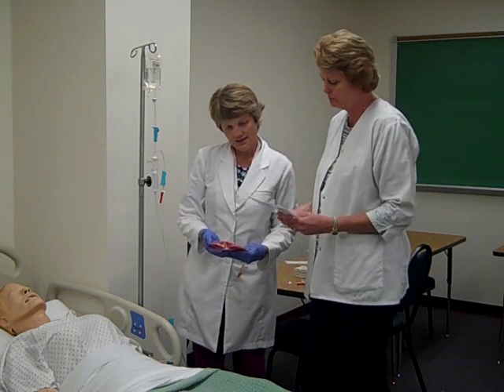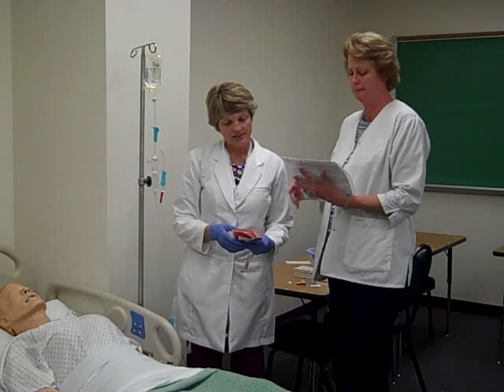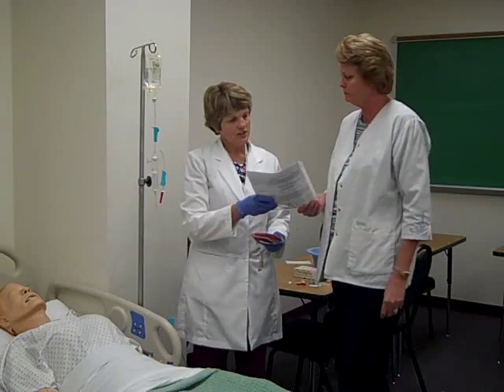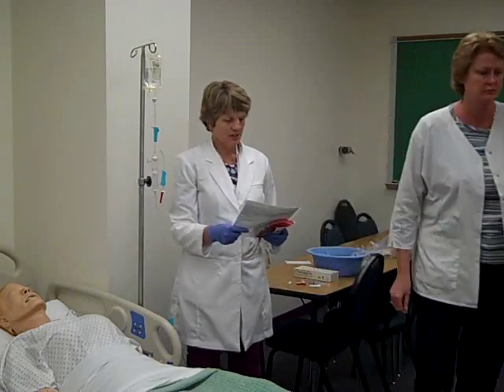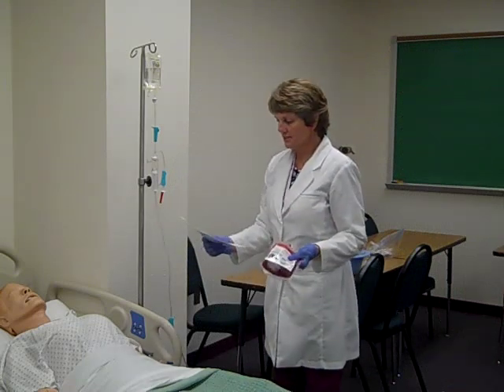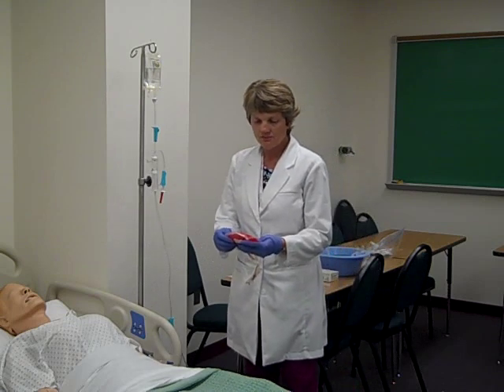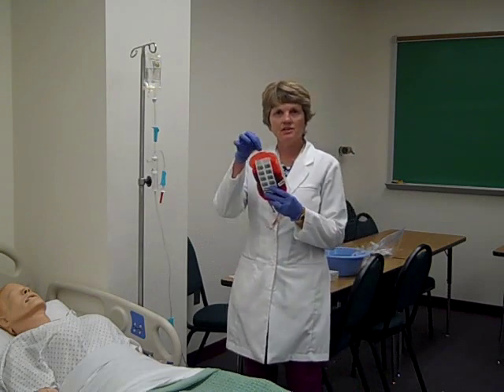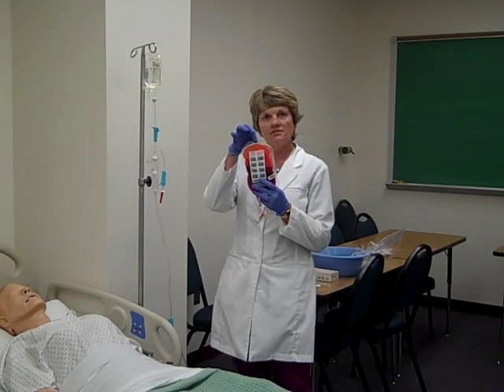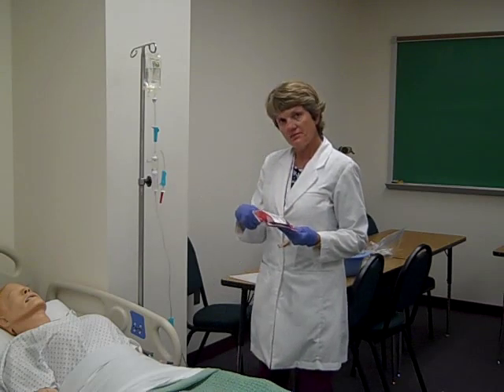Expiration date. Okay, and then Ms. Max, she's going to go ahead and verify that she's checked that information with me. She's checked everything. Thank you very much. And we do indeed have the right unit of blood for the right patient. And in real life, guys, you're going to have actually a little requisition form coming off the blood bag itself that has all the same information.